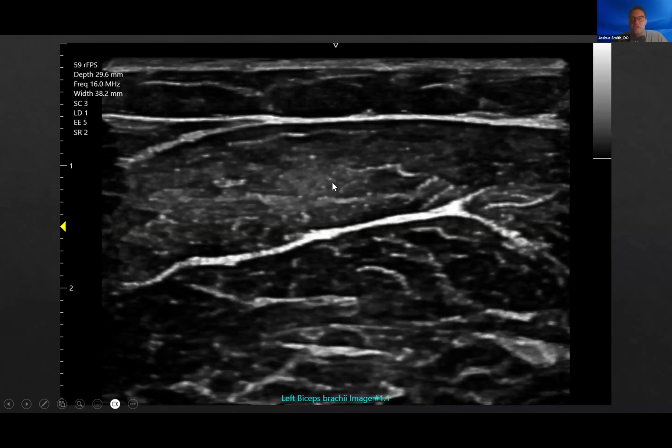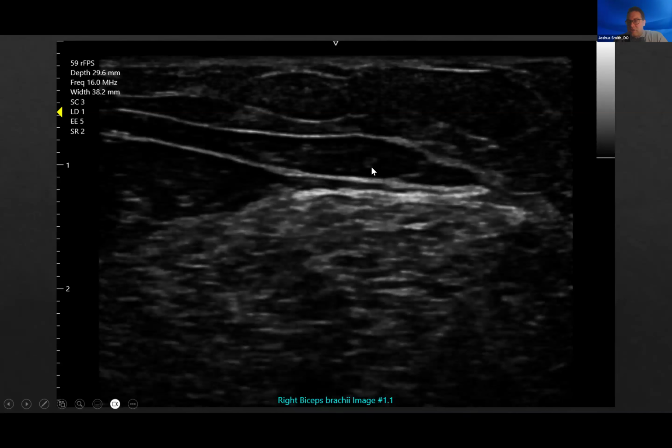Some people say this should look like a starry night, or a starry sky, with these kind of wisps of connective tissue throughout the musculature and then the normal muscle. And then here's this patient's muscle. So when muscle gets diseased, it gets brighter. So this is rather homogeneously hyperechoic throughout the musculature. And again, depending on the strength grading, it would likely be a good muscle to biopsy because it has significant abnormalities here. Because the question was, do I really need to do another EMG?